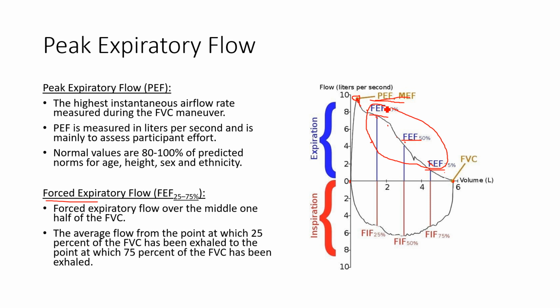Now, there are inspiratory flow measures as well, FIF, and that, again, is an effort-driven test. They actually get to total lung capacity. They take a really forceful breath in before they start that FVC, or forced expiratory maneuver.